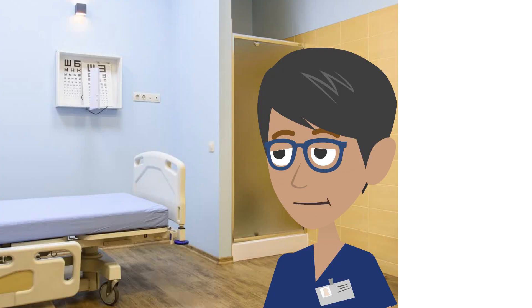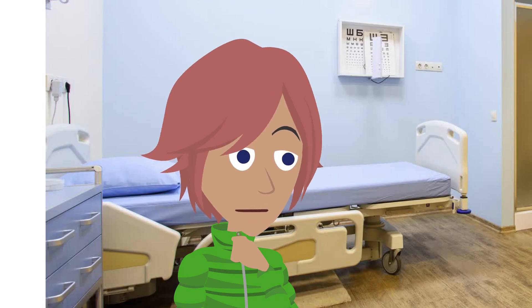Hi, my name's Henry. I'm going to explain how to use an inhaler which will give you a single dose of your asthma medication. First of all, can I ask for your consent to demonstrate the procedure and show you the equipment you need to use with the inhaler? Sure. That's fine.